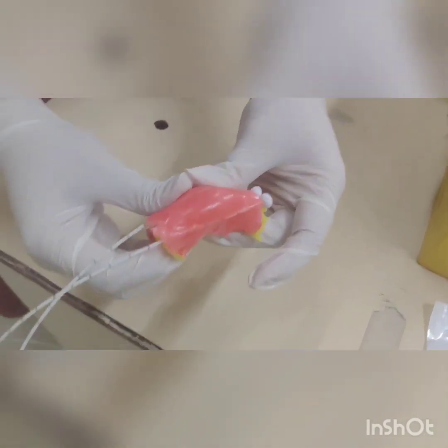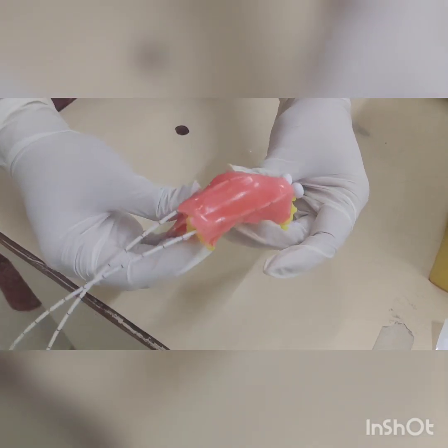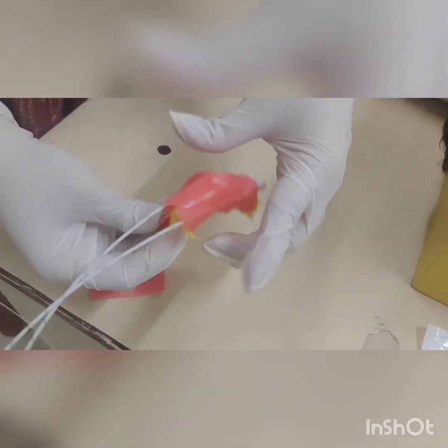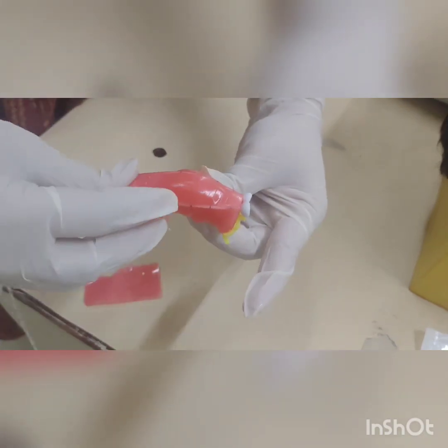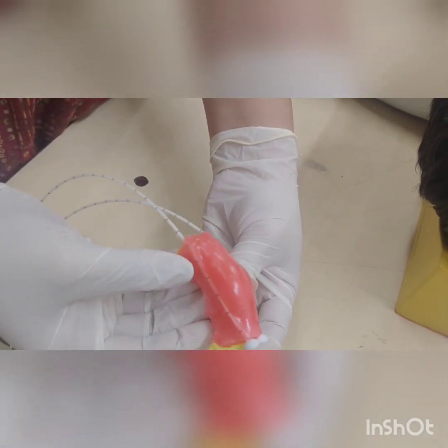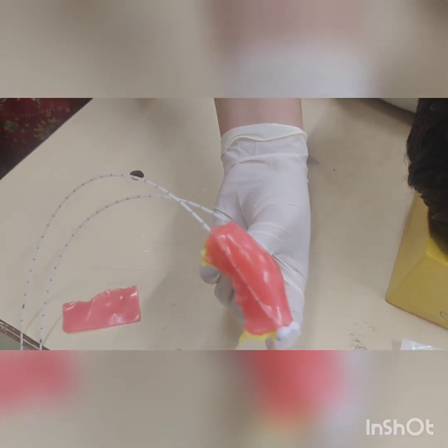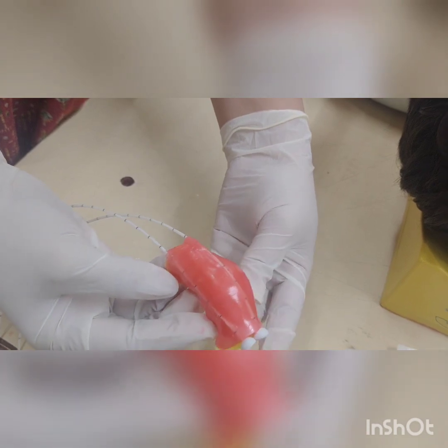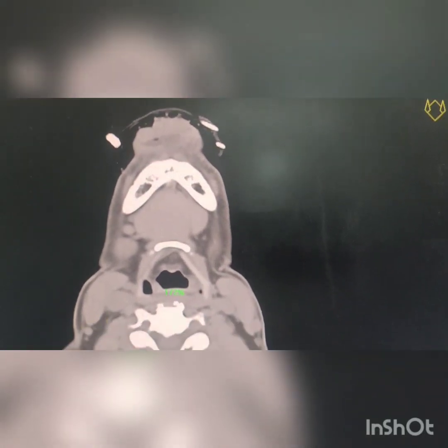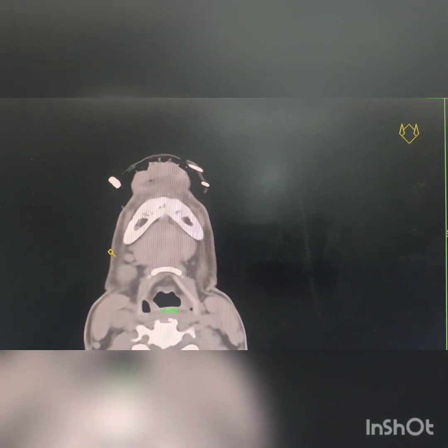Keeping some distance, you cut the wires, and again fix it. During treatment it goes inside the lip — so your lip mold is ready. Then put the copper wire and do a CT scan so that you can delineate the catheters properly in the CT scan.